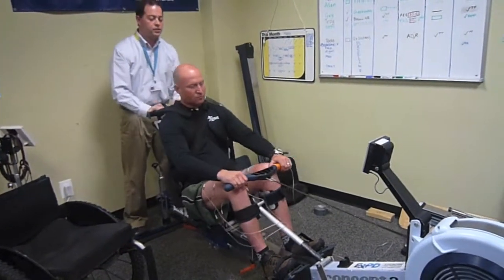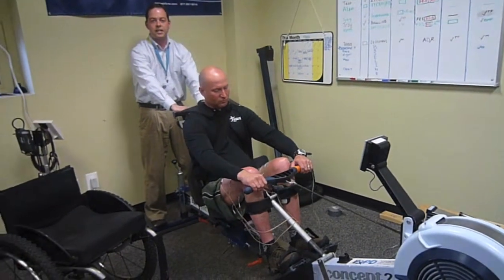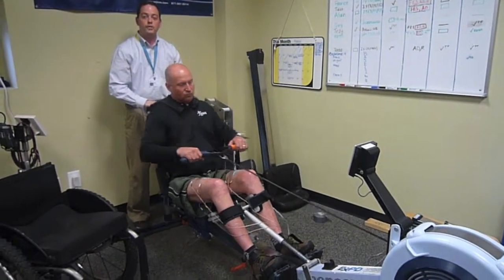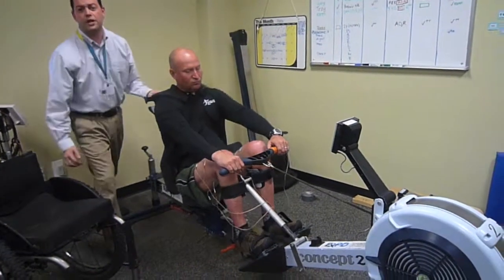The way he's going to row is he's going to press the button, the stim's going to go to his quadriceps, it's going to send him back on the rower, then he's going to join in with his arms and pull. Then he's going to release the button, the stim's going to go to his hamstrings and help return him for the next rowing stroke.